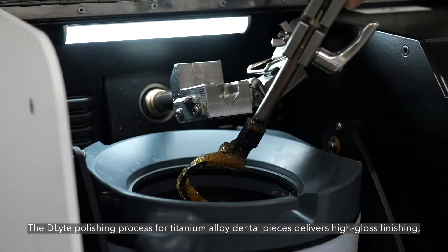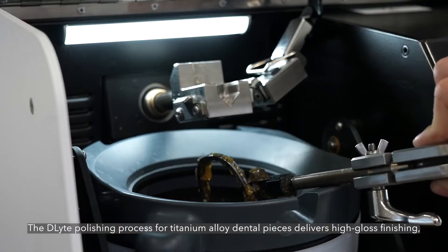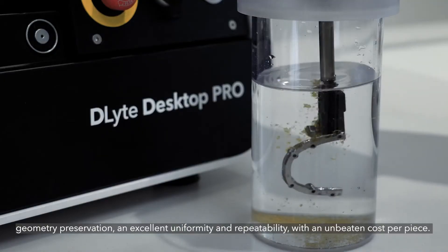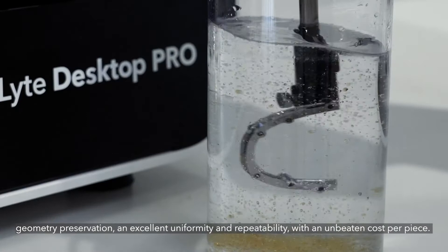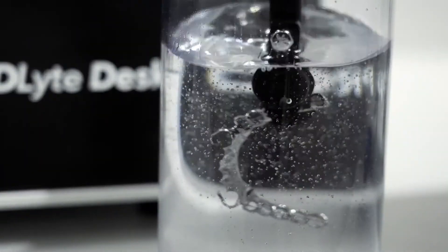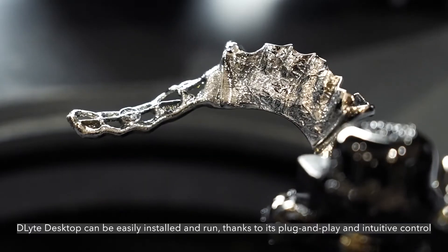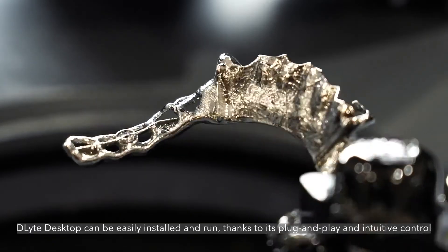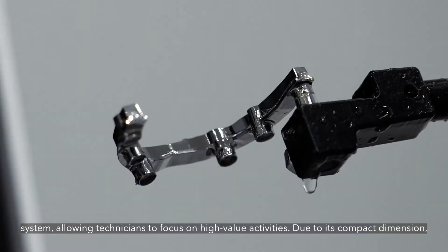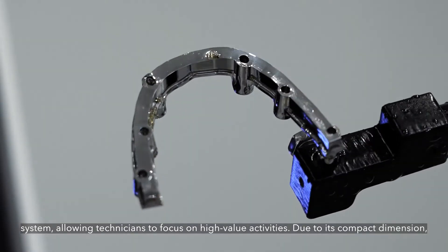The D-Lite polishing process for titanium alloy dental pieces delivers high gloss finishing, geometry preservation, and excellent uniformity and repeatability with an unbeaten cost per piece. D-Lite Desktop can be easily installed and run thanks to its plug-and-play and intuitive control system, allowing technicians to focus on high-value activities.